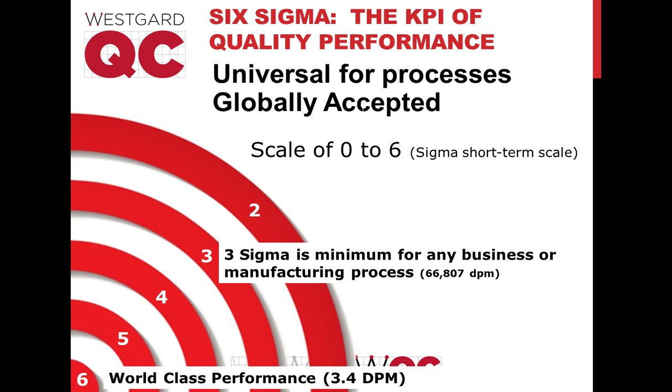Yeah, obviously the Westgard rules are most well known and applied in chemistry. If you look at our website, a majority of the examples that we show are on chemistry, but if it has a quantitative result, then that test can probably be applied with sigmametrics. So the sigmametric equation itself doesn't care if it's from chemistry or immunoassay or coag or infectious disease or hematology. As long as those numbers are coming in and they have the right distribution, we can apply sigmametrics.